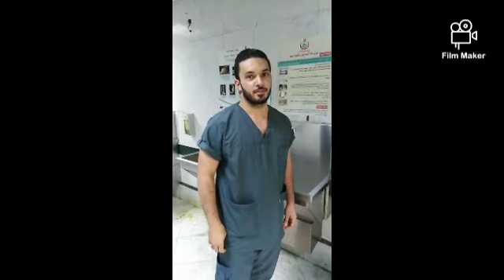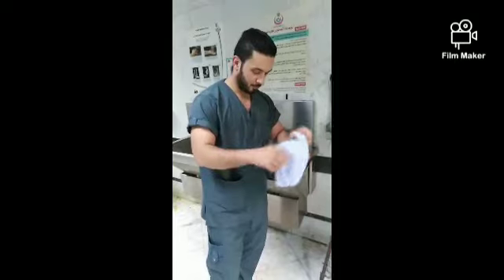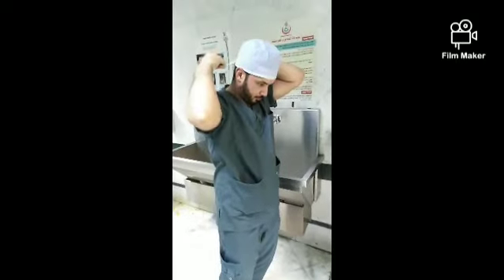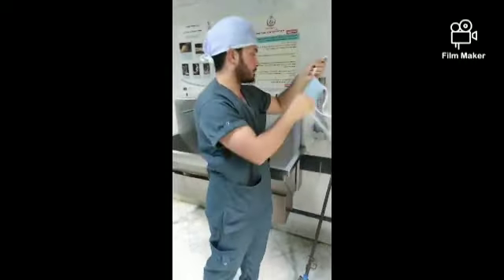First, we want to thank Dr. Mohamed for volunteering to perform scrubbing in front of us. First, he will wear his personal protective equipment. He will put on his overhead cap and his surgical mask.